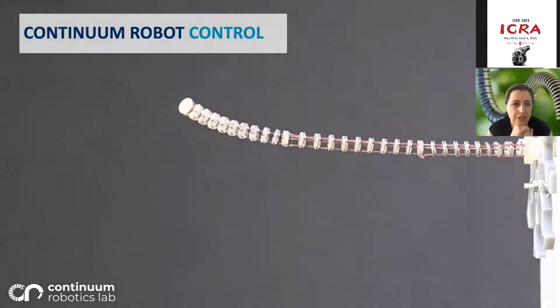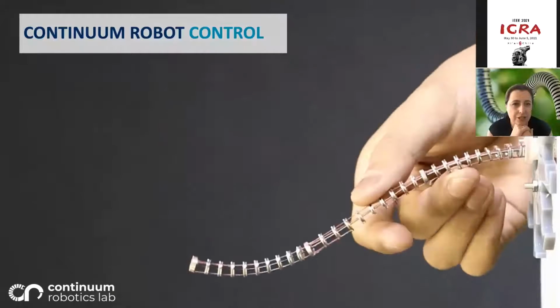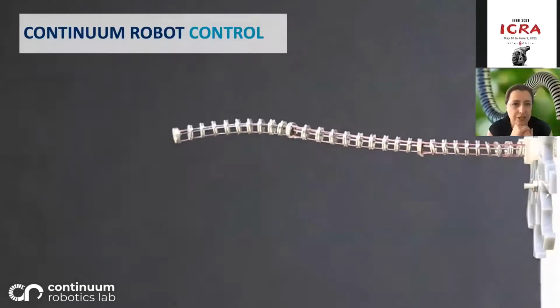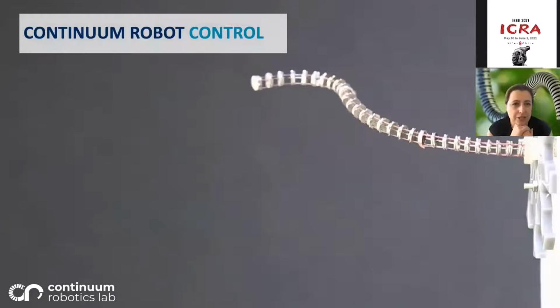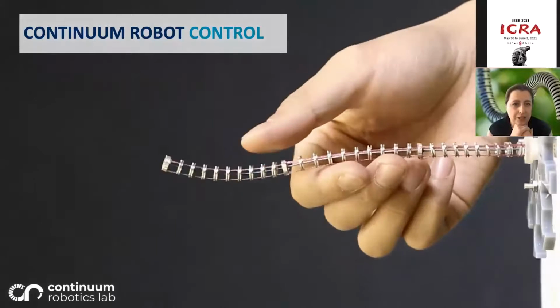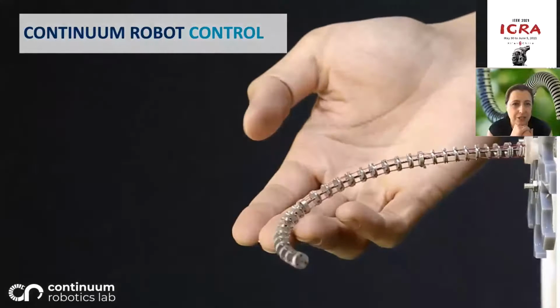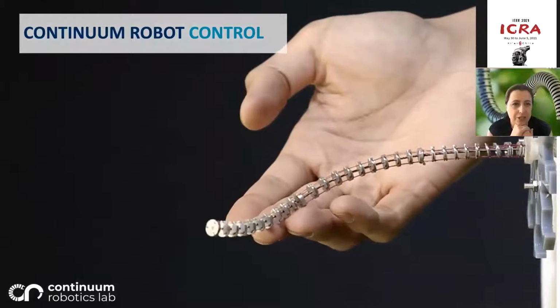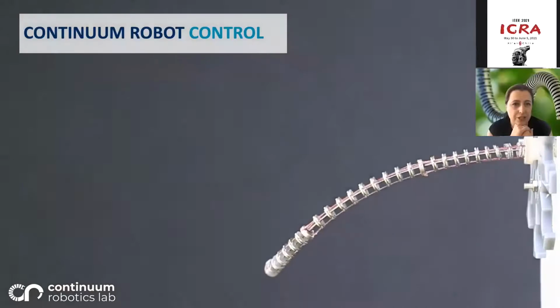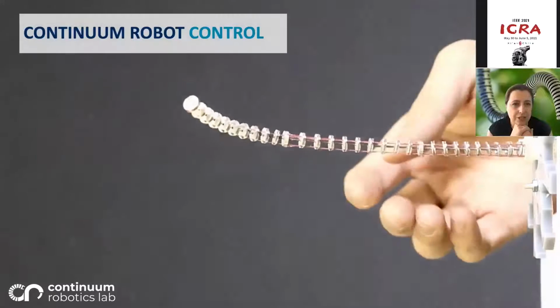And so continuum robot control is arguably not sufficiently explored today, in my understanding, because in the medical context, in the medical domain, we were good enough to focus on teleoperation most of the time. Physician stays in full control. We rely on the human in the loop. Human closes the loop. So many things have been easier because of that. But there's a huge opportunity space that's really not explored to its full extent, because now that we're moving out of that medical box, we can move towards more autonomy of continuum robots as well.